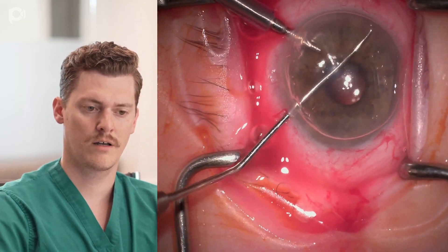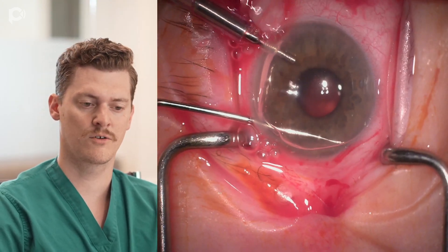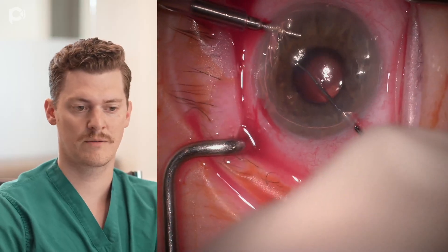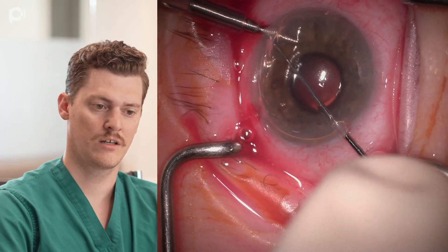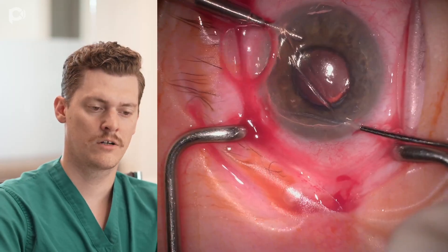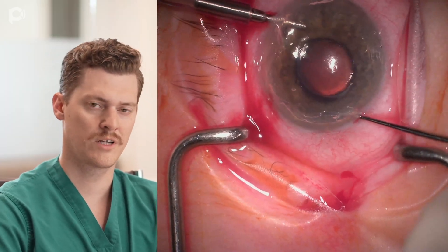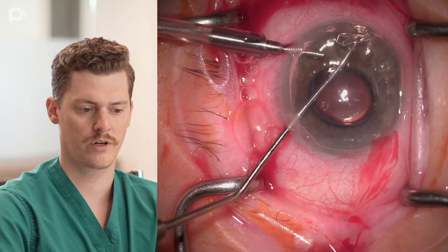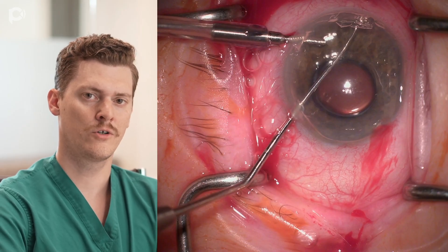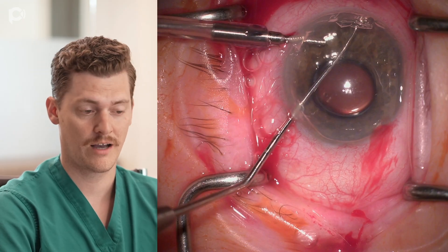With DMEK, we like to strip under air so that we get better visualization. It's also important in DMEK to be very comfortable using your right and your left hand, regardless of your handedness for surgery typically. I start my descemetorhexis with my left hand and finish it with my right hand. During the scoring process in the periphery, one thing I've learned is it's very important to be very gentle. You always hear the term scoring, but it's really almost like just tracing the posterior cornea — because if you push too hard, instead of just stripping Descemet's membrane, you'll also score into the stroma, which makes the descemetorhexis much more challenging.